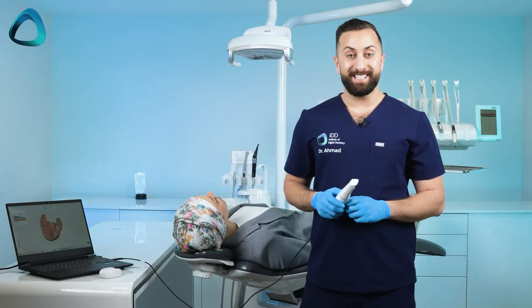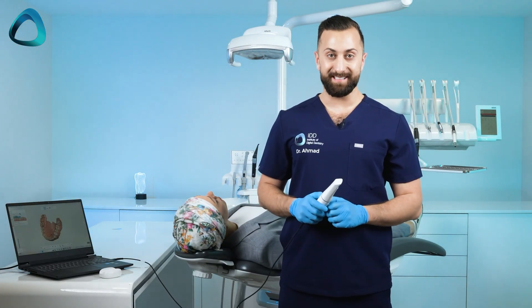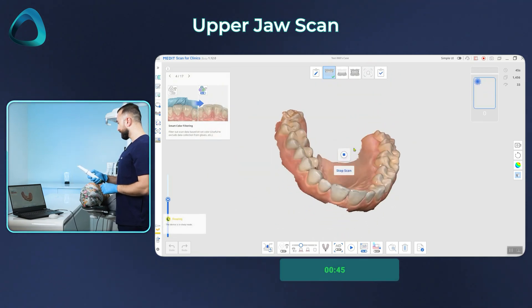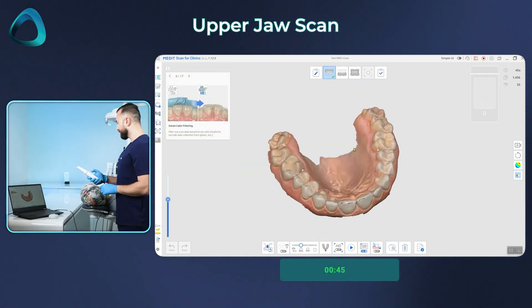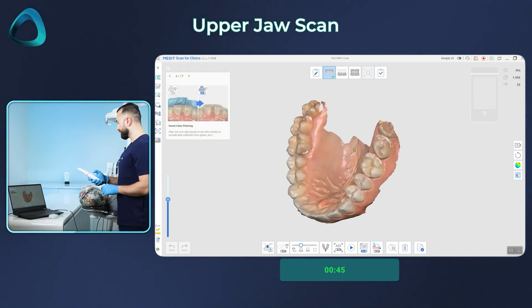As you can see, that is the upper jaw scan completed in easily 60 seconds. Using the touchpad and the touch band, we can control the entire scanning process without ever having to touch the laptop.